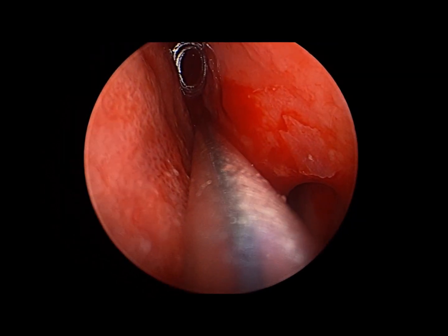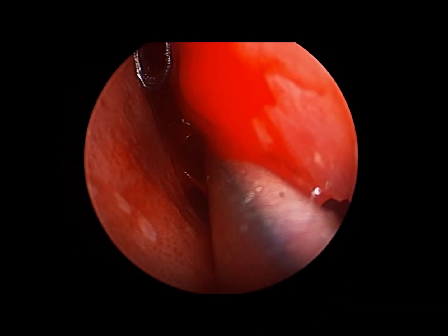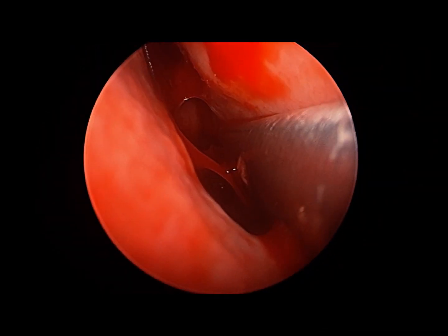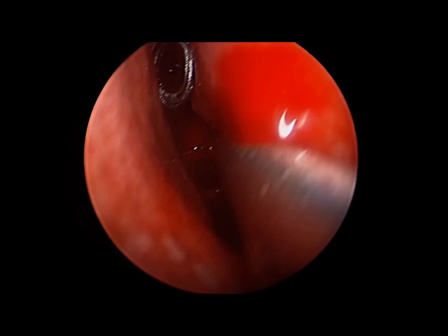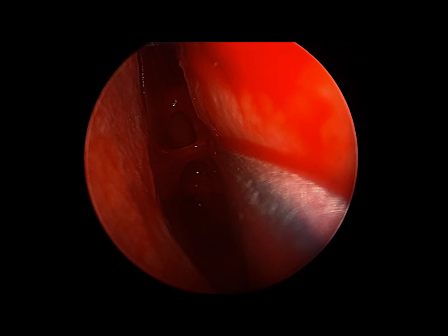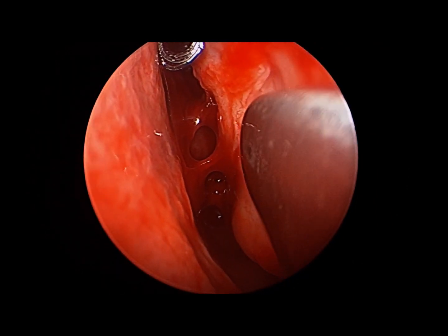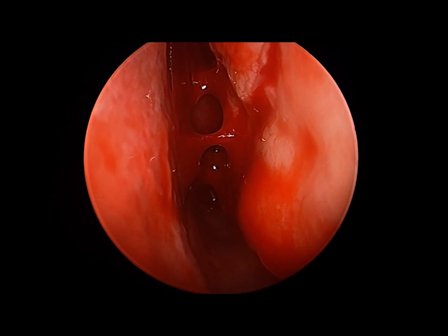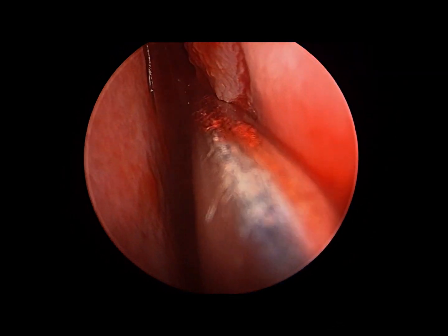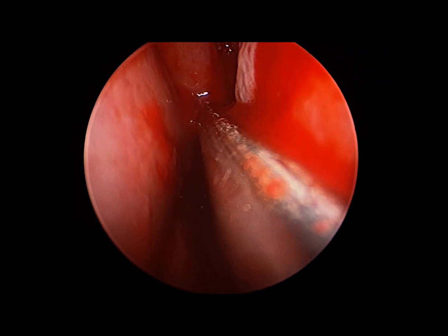We're also out-fracturing the inferior turbinate using a firm metal implement — in this case a Boise elevator, sometimes termed a butter knife, or a Goldman septal displacer. We first infracture the turbinate slightly and then out-fracture it, paying attention to the hinge area where it attaches to the lateral nasal wall. We're careful to do this after working on the submucosal layer to avoid small fragments of bone that could impede passing our radiofrequency probe below the mucosa. Note that coblation technology as well as judicious use of electrocautery can produce the same effect as the radiofrequency device.